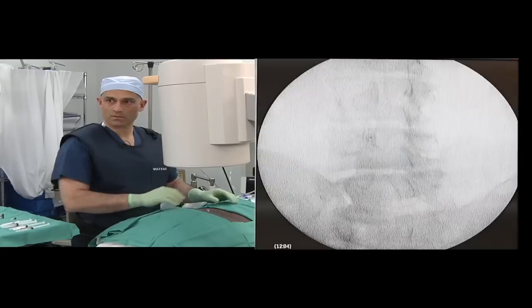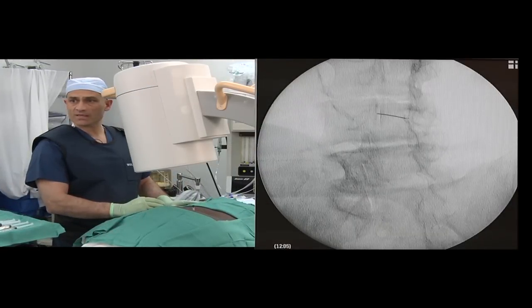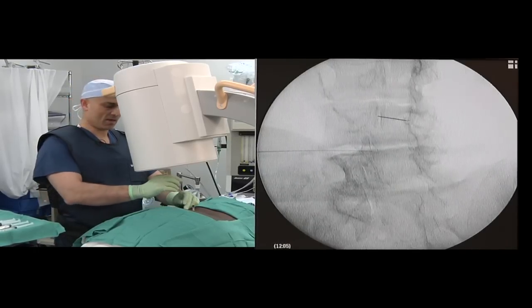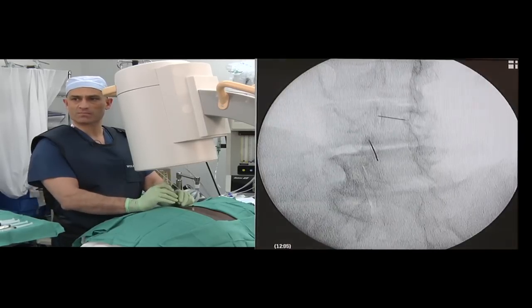The needle is then advanced into the joint. The level below is then addressed using the same fluoroscopic technique. The needle tip is placed over the joint space and advanced under fluoroscopic guidance into the joint.